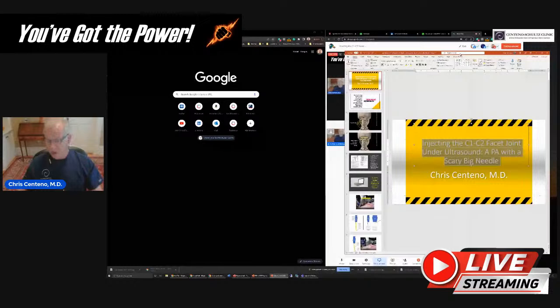A colleague sent me this video from a prolotherapy clinic — I'm not going to talk about the name of the clinic or the provider. It was a physician's assistant injecting what she believed to be the C1-C2 joint under ultrasound. As an expert in this area, I was able to look at that video, see what she was doing, see where the needle was, see where the probe was, and see what that was showing on the screen.